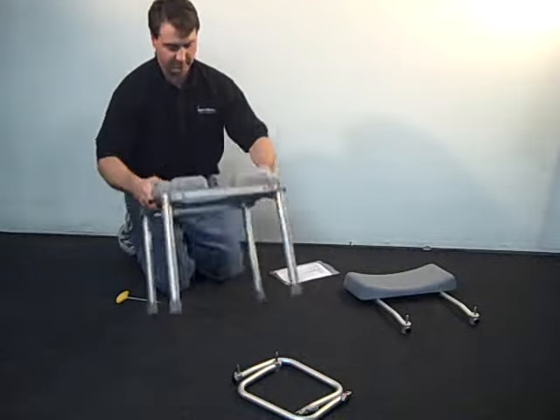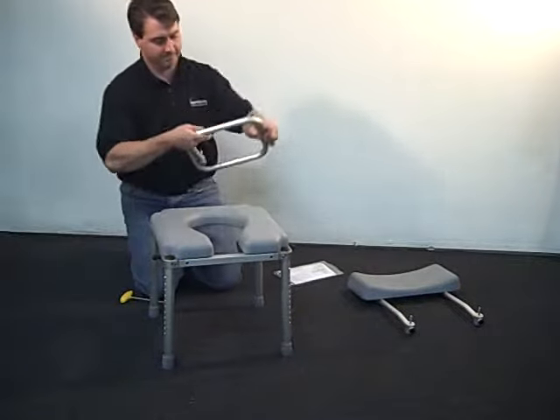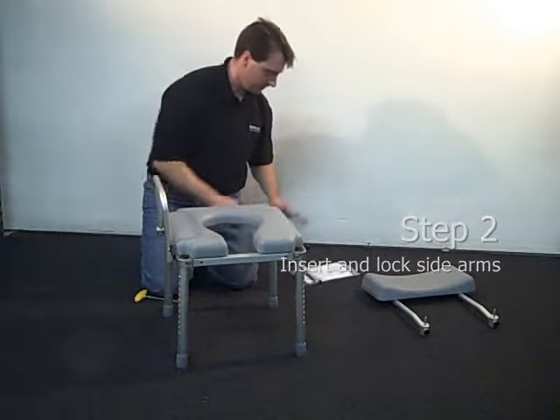Once the legs have been installed, turn the chair right side up. The next step is to install the swing-away arms by first slipping the end of the arm with a steel pin into the matching hole in the frame.